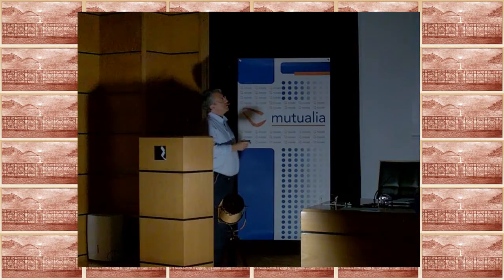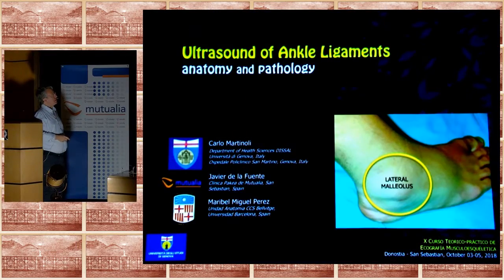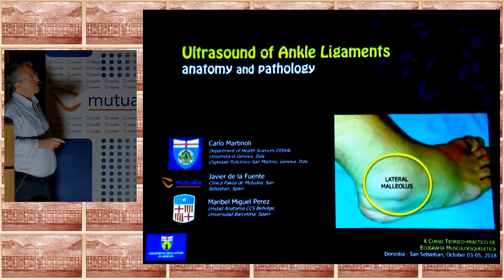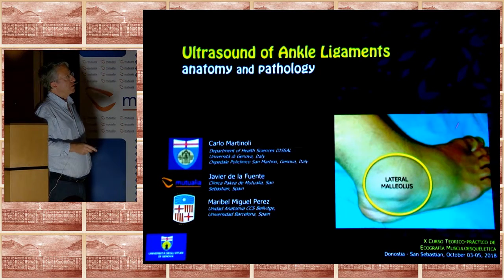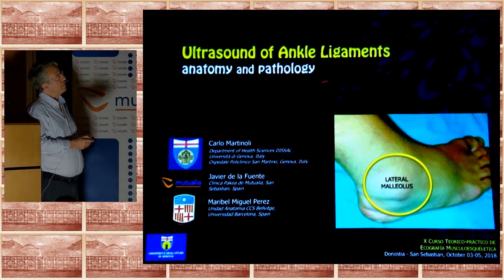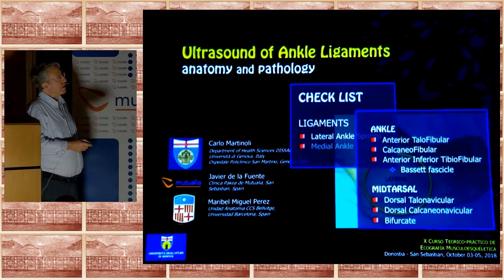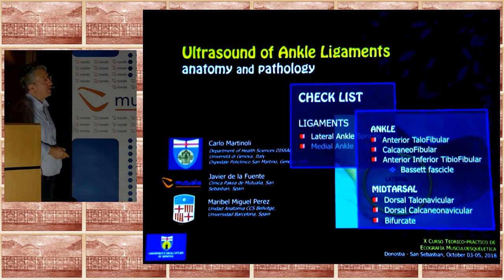So now we continue to speak about the ankle. Specifically, we'll address the lateral aspect of the joint for ligaments. We have a list of ligaments to check, and all of them are really important.